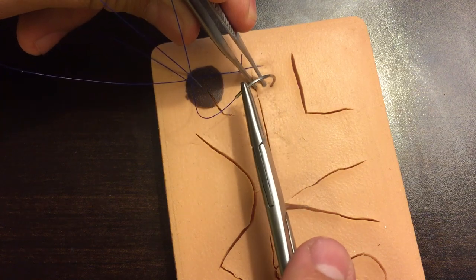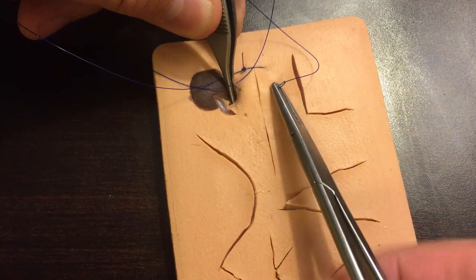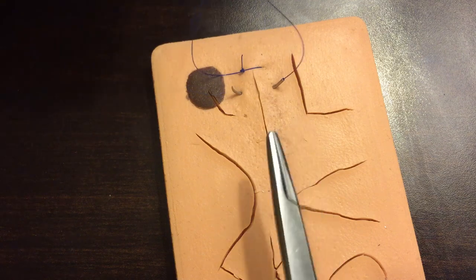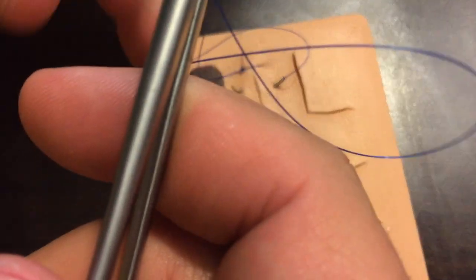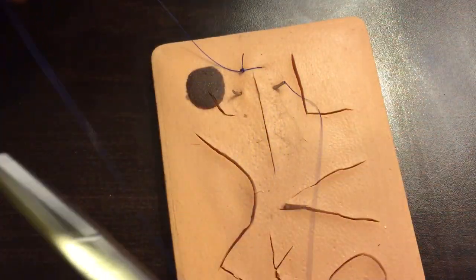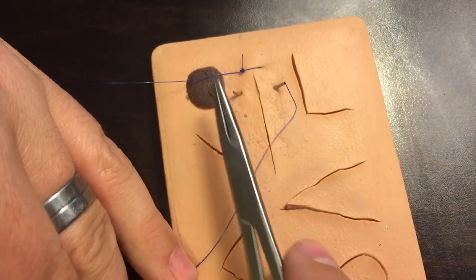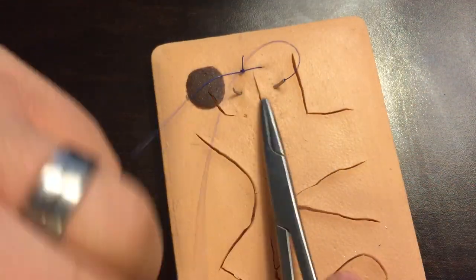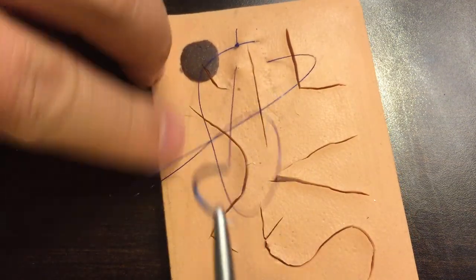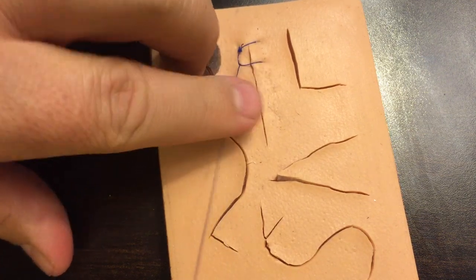So our next throw here, again, 90 degrees. Make sure that you're doing it in a very similar way as that first throw that you just did. And notice how I went perpendicular to the laceration. Now the difference here with other continuous, this with the locking continuous, is I'm going to make sure that with this loop, notice this loop that's made with my residual suture, I want to pull my needle up through this loop. Rather than pulling it up here, I want to pull it up through this loop. Now you'll see what that does. As I pull this tight, it creates a little bit of a self-locking mechanism. See that?